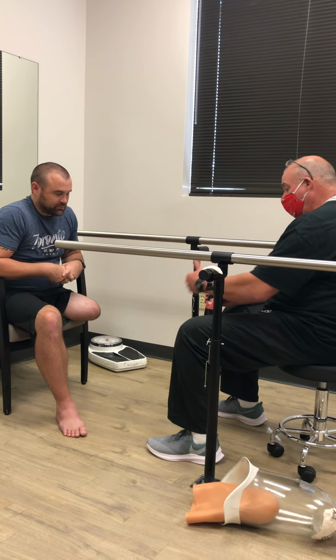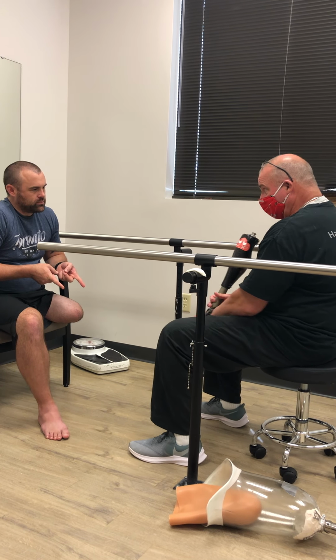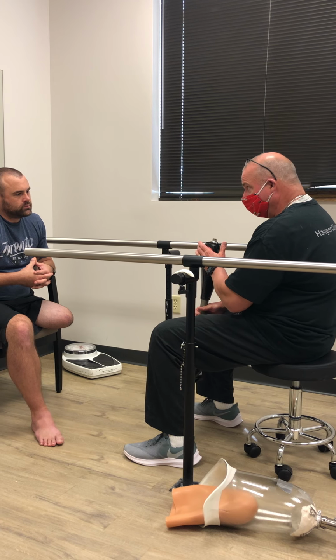So lightweight is what I would shoot for. I mean, this is not a light knee, so if you take a heavy boot and put it on the end of it, all day, you already have a higher energy expenditure.